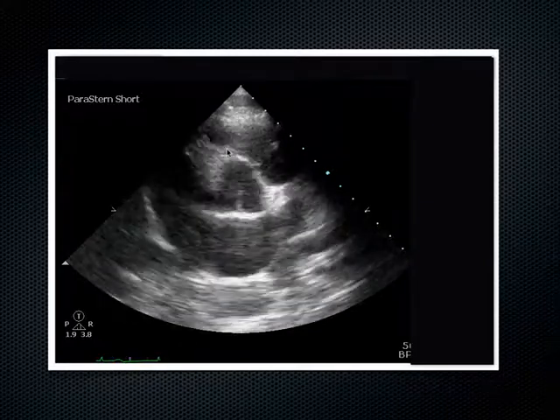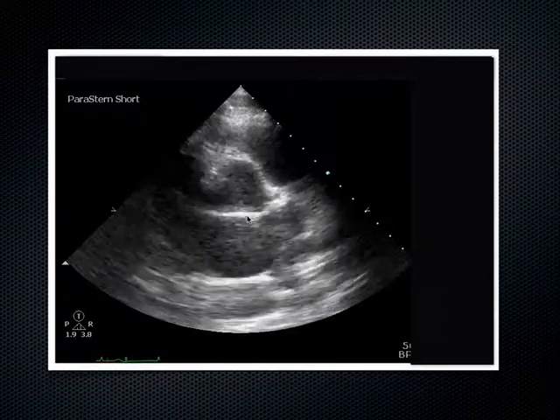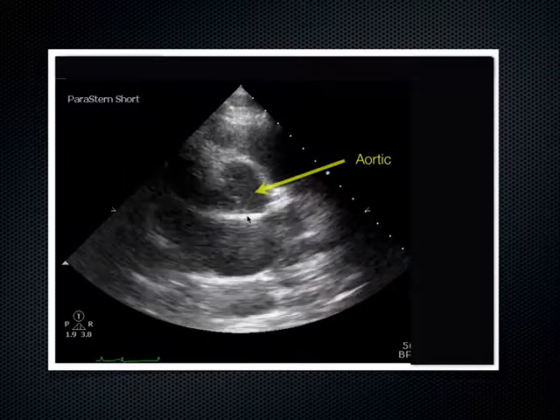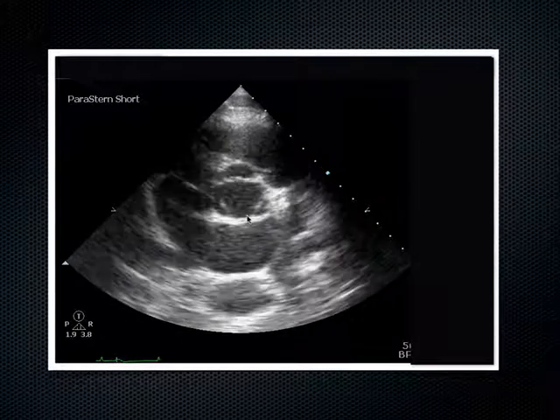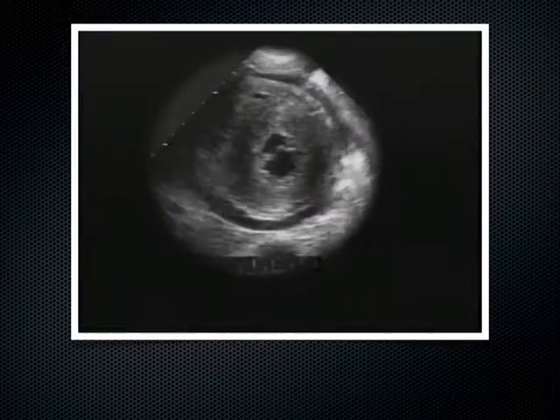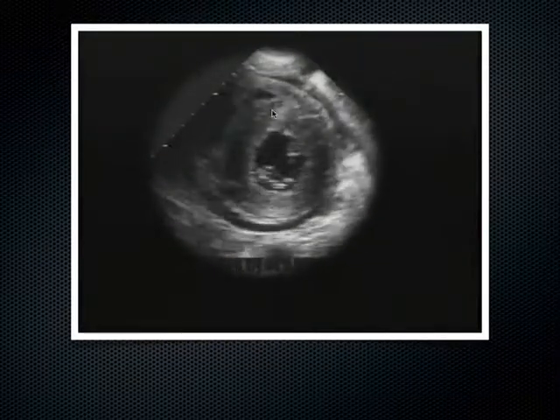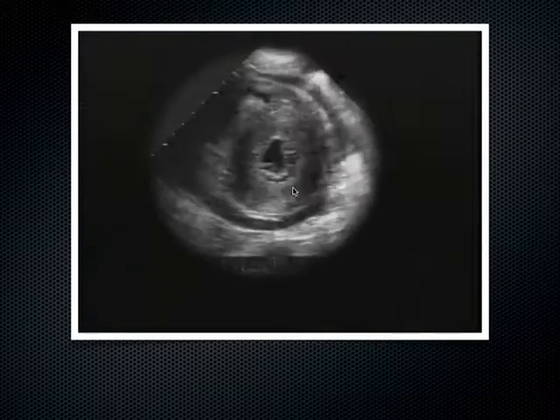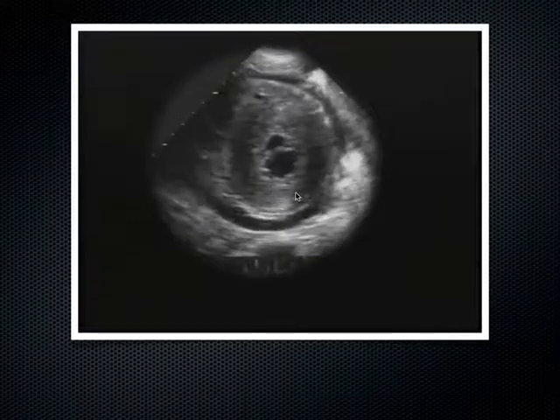Here's an example of a thickened left ventricular wall in the parasternal short axis, with the mitral valve fish mouth view bouncing up and down. The left ventricle and a portion of the right ventricle are visible in this view.